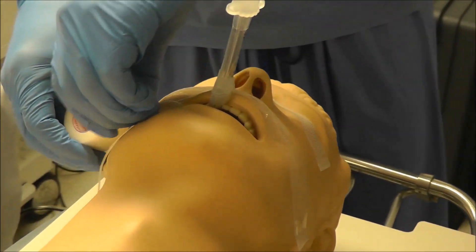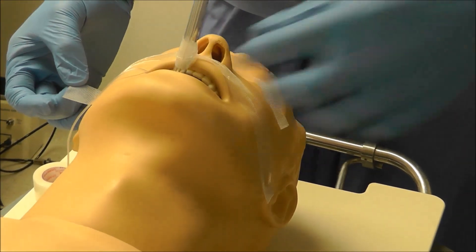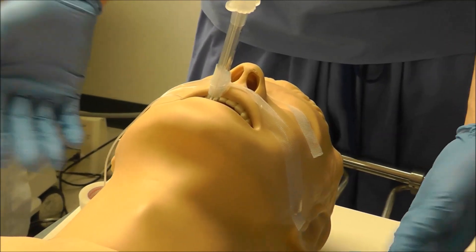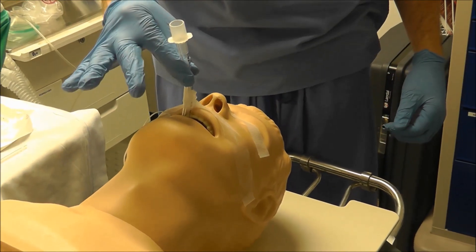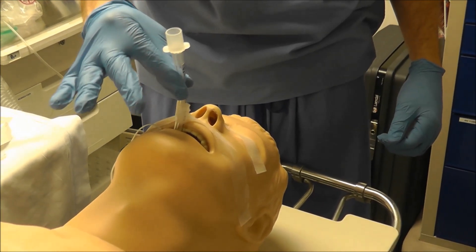This is all you really need to do. And then when you pull it, you make a tab on this side as well. So when it's time to extubate this patient, you can pull the tape off really easily. What I'm just really trying to demonstrate is that it's secured close to the lips, close to the face, so it's not going to move anywhere.